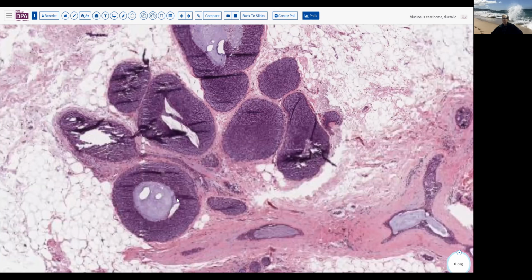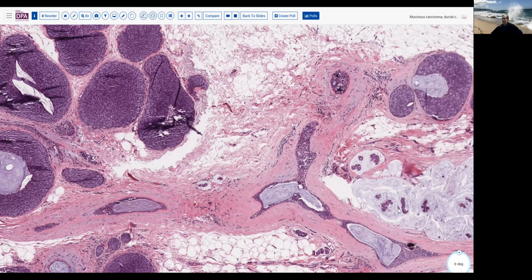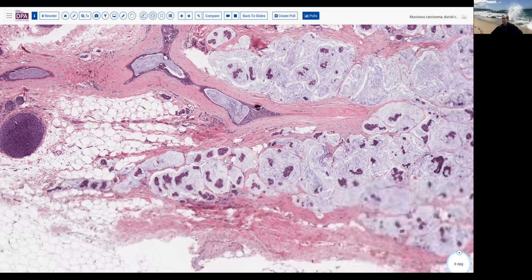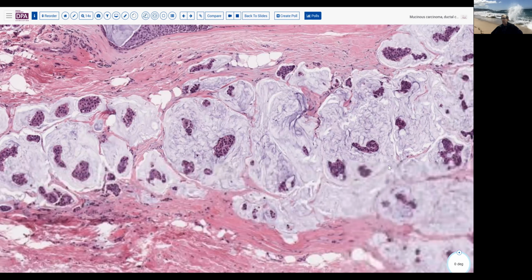And you see it's producing mucin and so forth. And then as it escapes into the stroma, you see that sort of happening. It's sort of extruding the mucin here. And you can see it sort of spreading and the tumor cells free floating into the lumen.